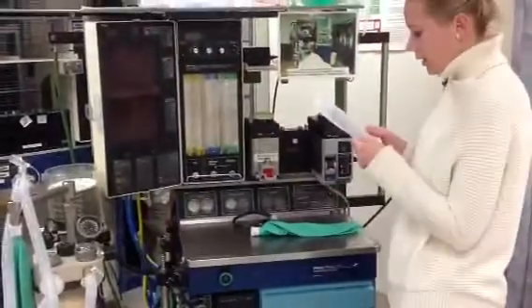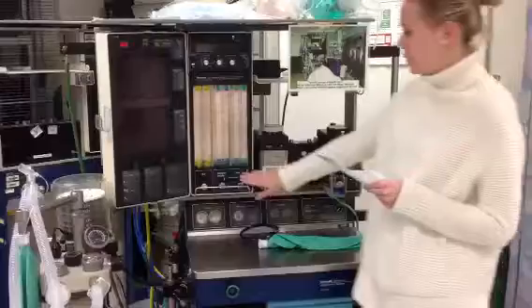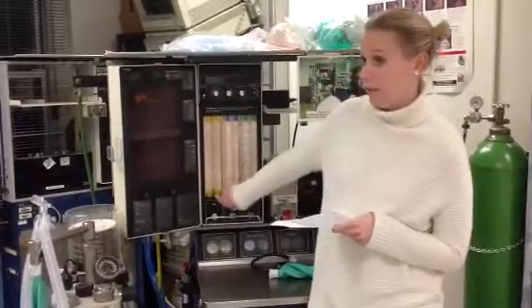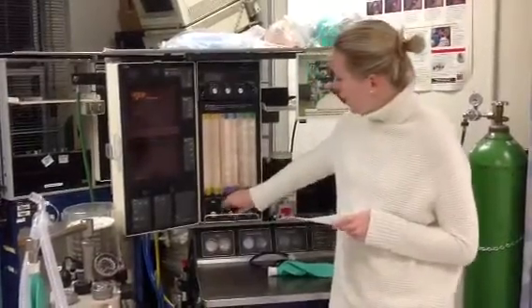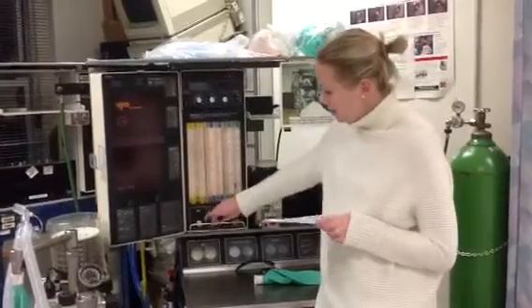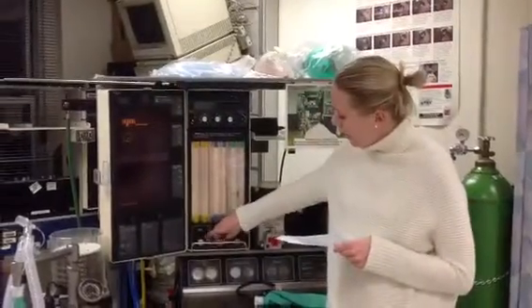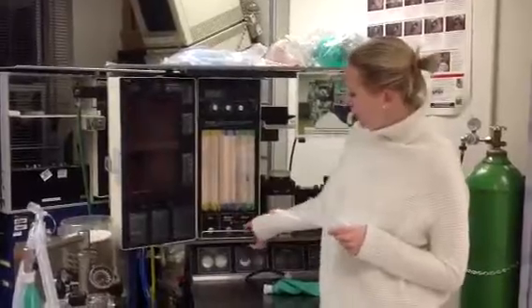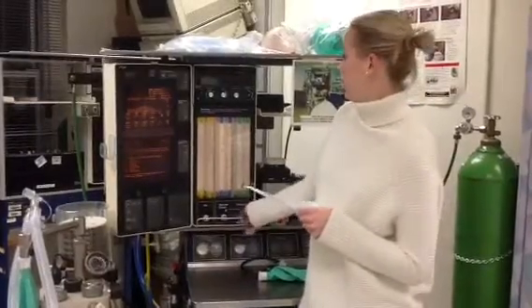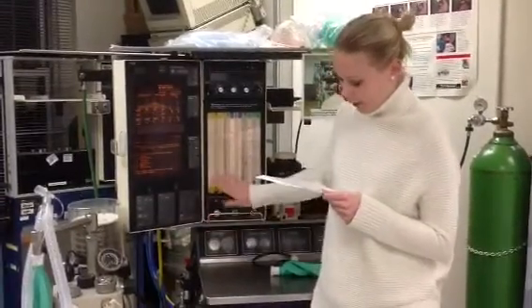and we're good. So then you turn on the master switch on the right hand side and test your flow meters. You're going to test each one and make sure they go up smoothly, and then you're going to attempt to make a hypoxic mixture with nitrous and oxygen. Make sure that the ratio of nitrous to oxygen is 3 to 1. Bring your nitrous all the way up, and then once it's all the way up, bring your oxygen down all the way, and make sure that nitrous follows. This machine doesn't work. And make sure all of your flows are back down when you're done checking.